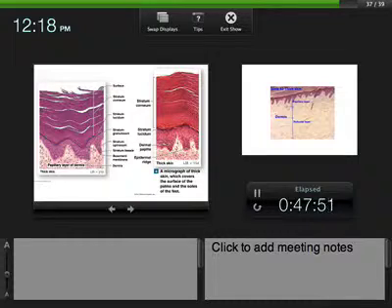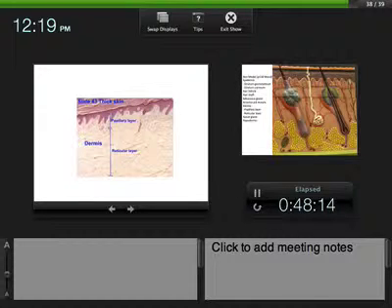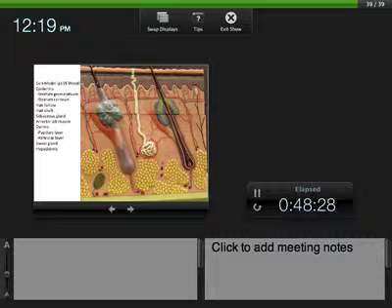This papillary layer of the dermis has all these papilla, these hills, these ridges, and the epidermis grows off of that. This gives the skin an ability to have sensory receptors, these Meissner's corpuscles that get embedded in the papilla, and helps with sensation in the skin. All right, so here is the dermis, and we see the thin papillary layer at the top of the dermis with the epidermis on top, and then this reticular layer, which is basically whited out in this slide. Okay, here's my last slide.